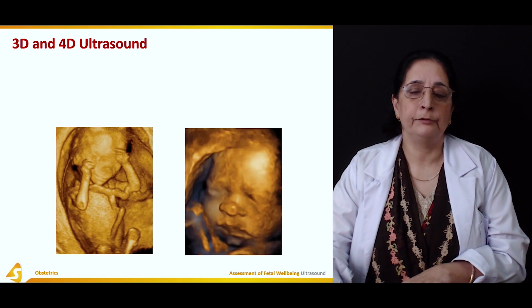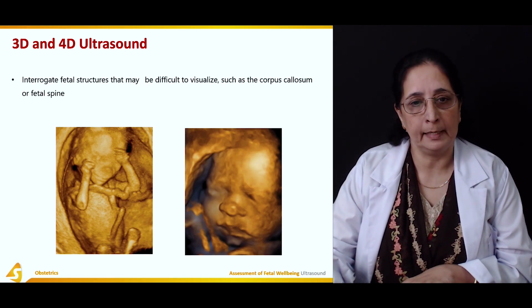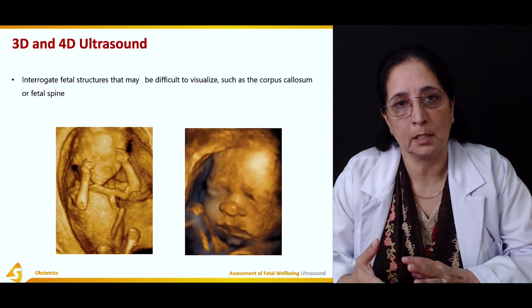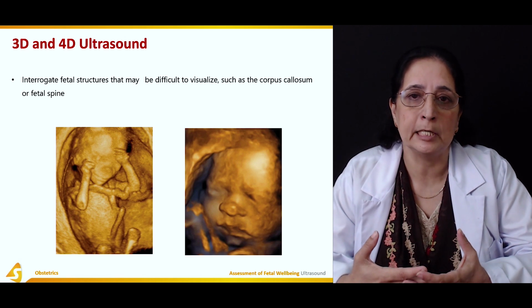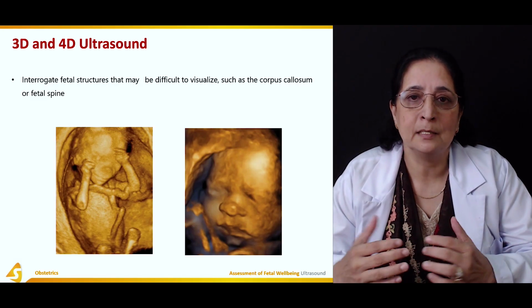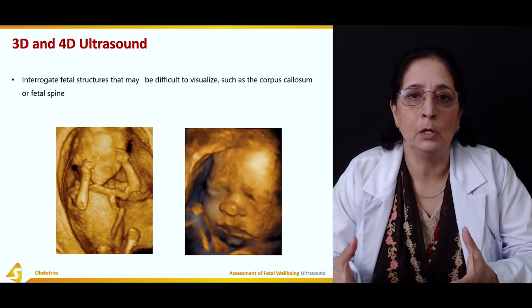Then we also have 3D and 4D ultrasounds available, as compared to routine 2D ultrasounds. 3D ultrasound gives a clearer visualization of the baby, and this is closer to the real picture of what the baby will look like.